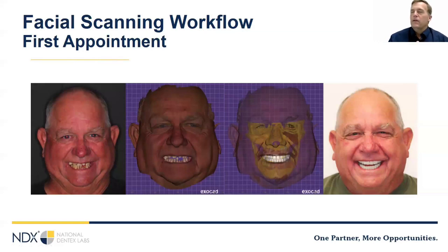So I think that with facial scanning and with correct alignment procedures, it allows us technicians, when we're designing the case, to actually see what you're seeing and design not to something that kind of looks good in the person's face, but actually put the teeth in the right position relative to the patient's face. When you're doing facial scanning with dentures, you use the reference denture workflow, then add your facial scans. Using your facial scanner, you scan the patient wearing the denture with a retracted smile, Duchenne smile, normal smile, and relaxed lip. Then you send all those to the lab, so you're sending a lot of files along with your reference denture scans. Your laboratory will align everything, and then they'll actually do the design in the mouth.